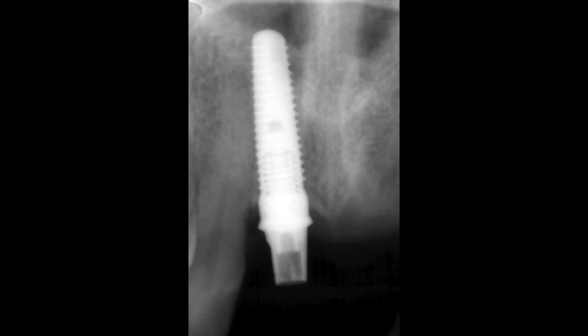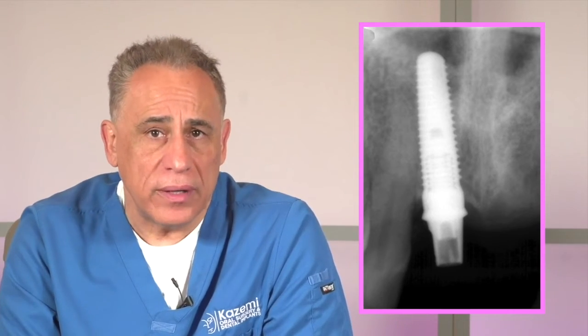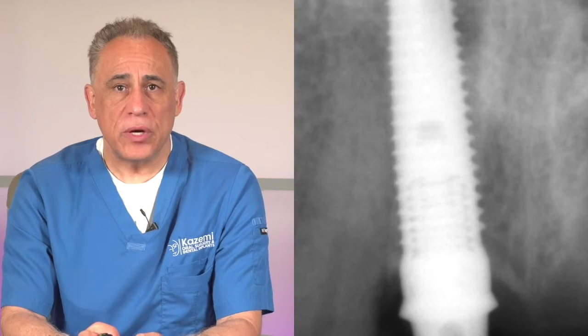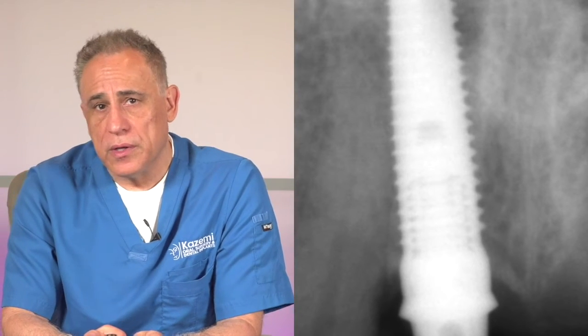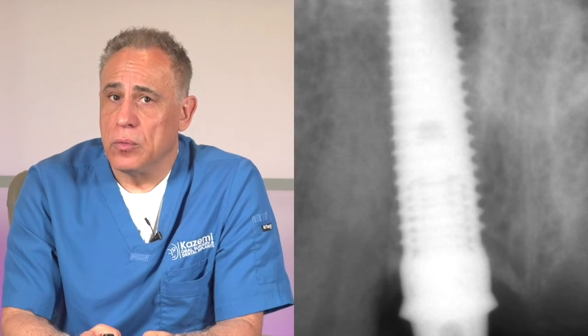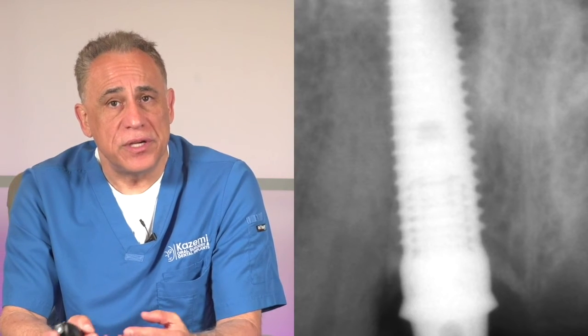This is a Cam Log dental implant and I will now demonstrate how it can be removed conservatively and quickly with a reverse torque technique. As we note in this case, the implant is very close to the adjacent tooth, so the old conventional technique of cutting the bone around it will simply not work as it will be too damaging to the adjacent tooth and structures. Instead, we will use a unique technique to rotate the implant out.